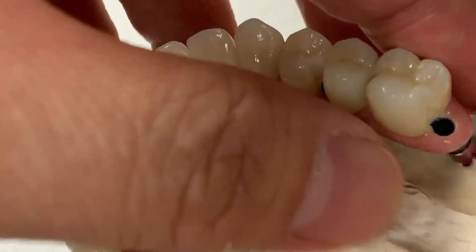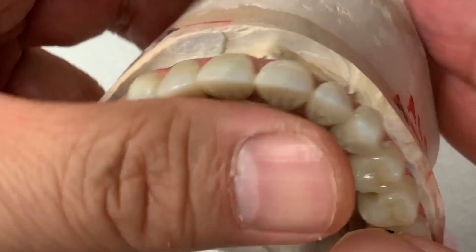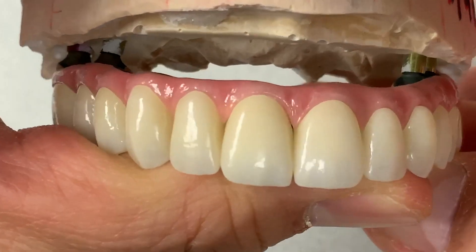We just put a little bit here — the layer, just a little bit. I don't want too much layer, just like that. It looks like a piece of diamond. And then we put it together, and then it makes us extremely happy.